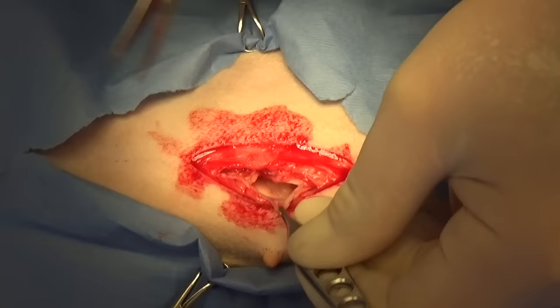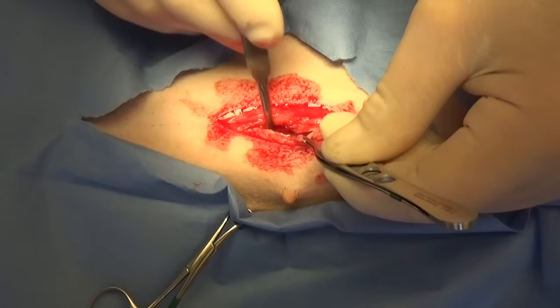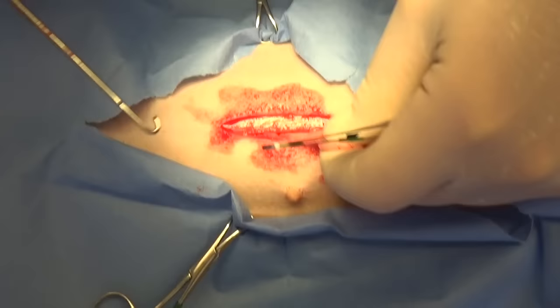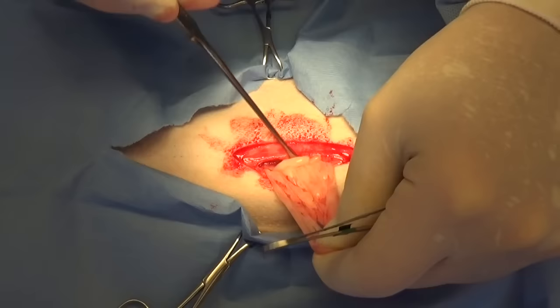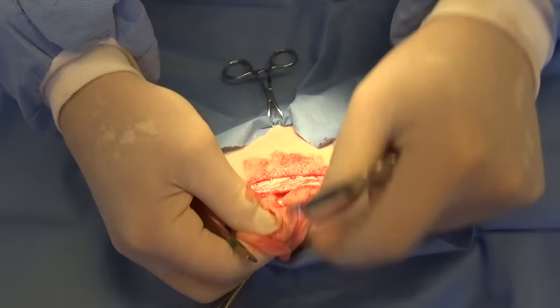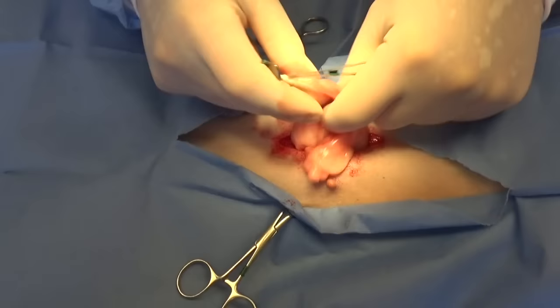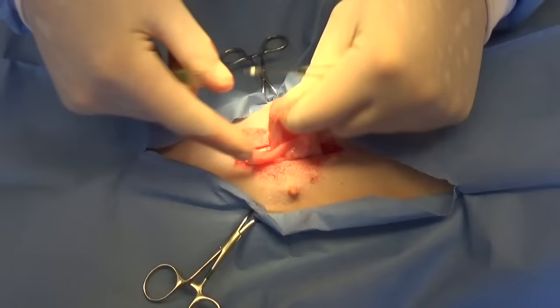And then what I'm going to do is I'm going to take a hook, a fishing hook. Isn't that pretty? And I'm going to go down in the abdomen and fish for the uterus. Why do we call it fish? Well, because it's like throwing your line in a pond where you can't see the bottom. So I can't really see the bottom, but I can go in there and fish for things. And I know kind of what I'm looking for because this fat is very creamy. It's more like a creamy color instead of a red color. And that's always where the uterus is.